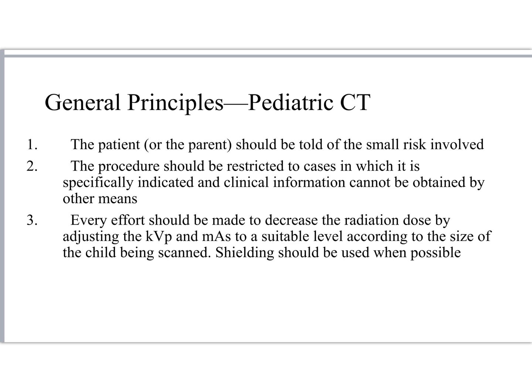Anytime we're using a CT scanner to examine a patient who's pediatric, who's small, we need to use specific protocols just for pediatric scanning. This is one of the reasons why there's pediatric hospitals, is they have those special protocols built. Frankly, some general hospitals do not have these protocols built. And so I've had to go into facilities and build pediatric protocols because they didn't have them, right? And that's part of what we're about in this class, is learning how to build those protocols. So we need to make efforts to decrease radiation dose by adjusting all the various factors prior to doing any kind of pediatric examination.